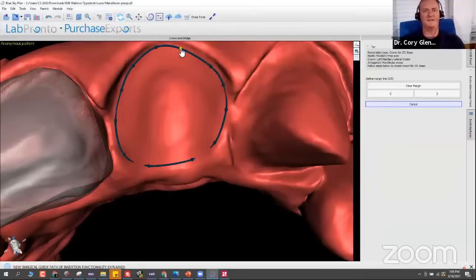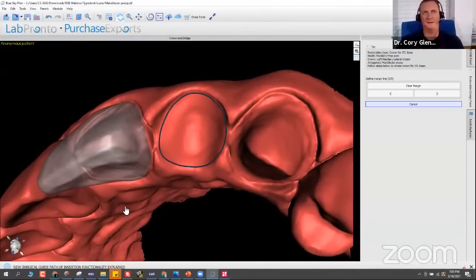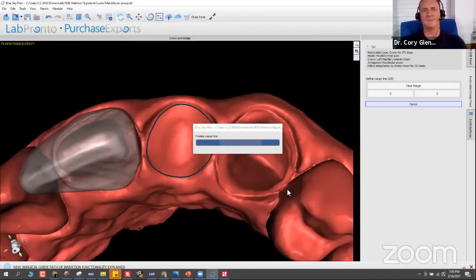But with that said, if it's just a matter of pulling teeth in and orienting them, not long at all. You can actually use the denture module to pull in an entire dentition, and the teeth are on a chain where you can conform them exactly to the arch that you're working on. So it's very dependent on the individual case, but I could do a full arch provisional wax up in, I don't know, 20 minutes. That's a guesstimation, but I'd say that's probably pretty close.